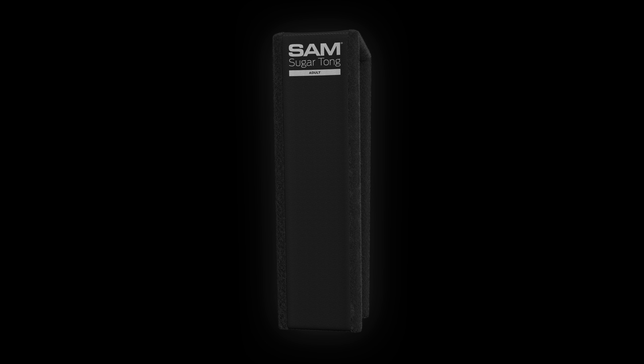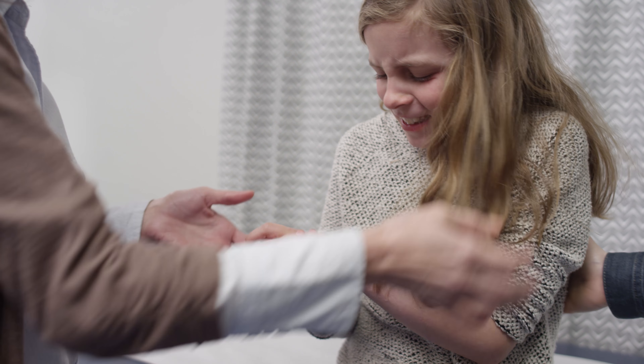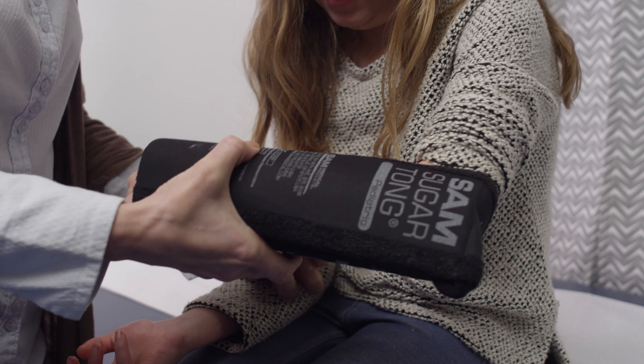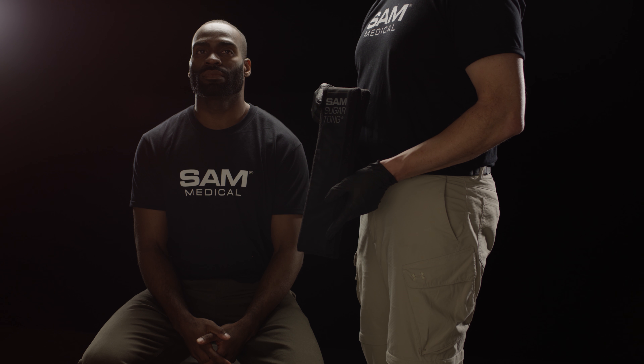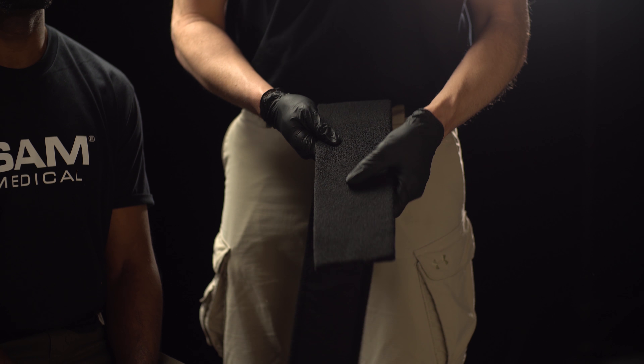This is the Sam Softshell Sugar Tong Splint by Sam Medical. Select the appropriate size of Sam Softshell Sugar Tong Splint according to the size of the patient's arm and wrist.